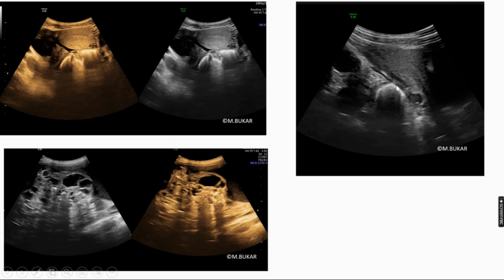Here, note this area of calcification and the tip of the iceberg sign. Here again, look at the multilocular solid lesion with bright lines and dots, bright lines and dots with extensive shadowing. Again, here, note the content of the cyst and the multilocular solid nature with extensive shadowing.